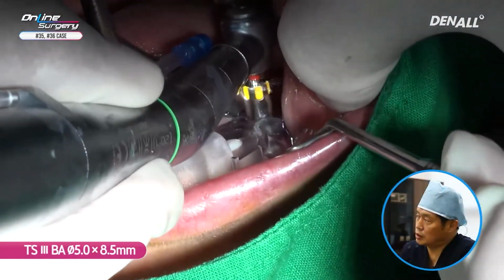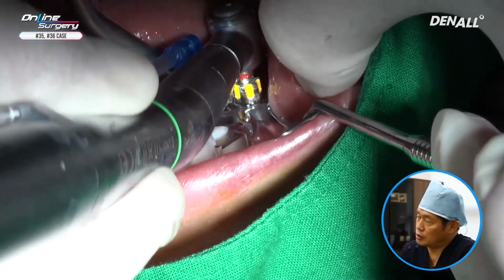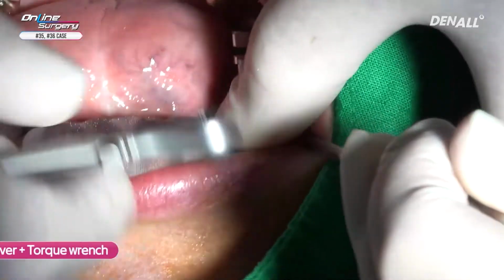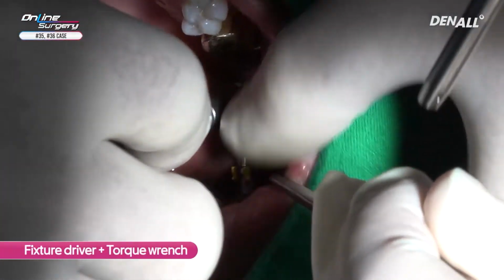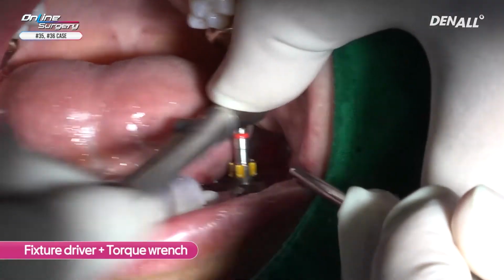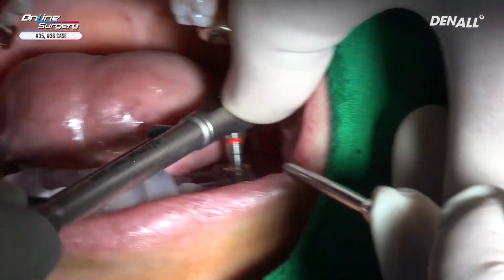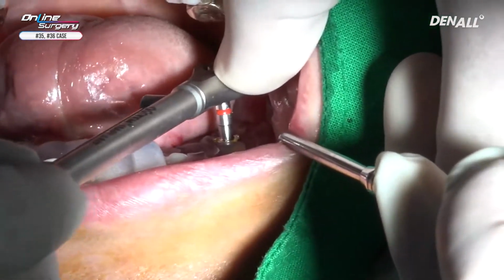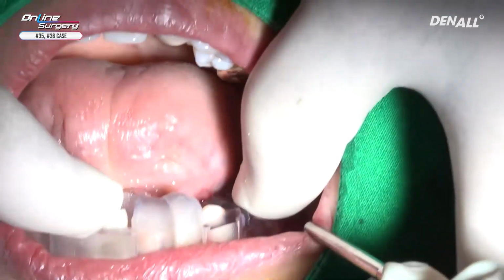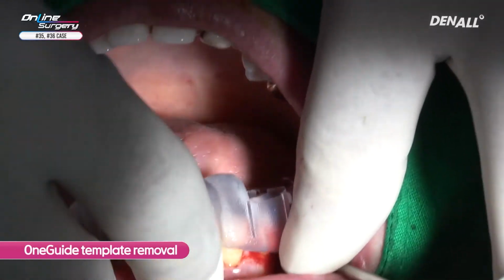As mentioned earlier, considering the patient's level of mouth opening, I decided to place an 8.5 implant. Say ah wider. All implants have been placed.